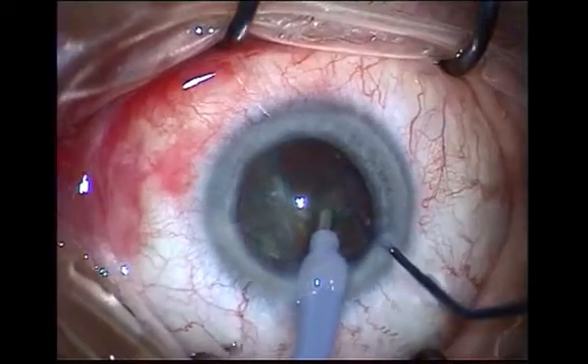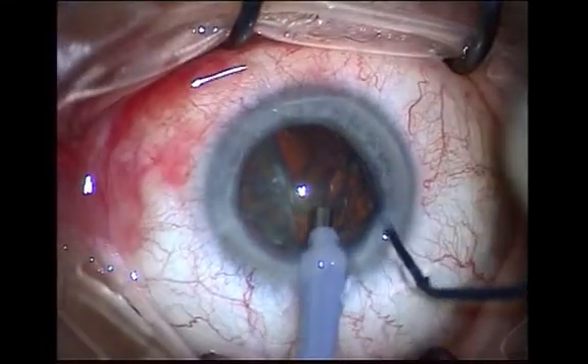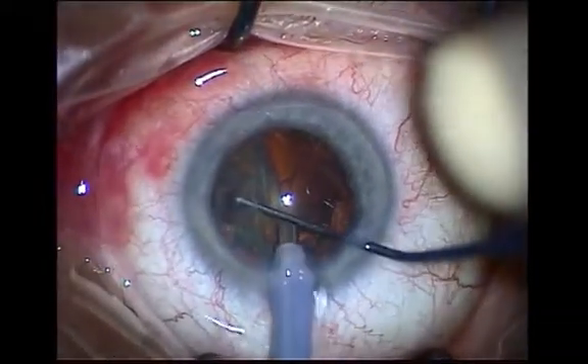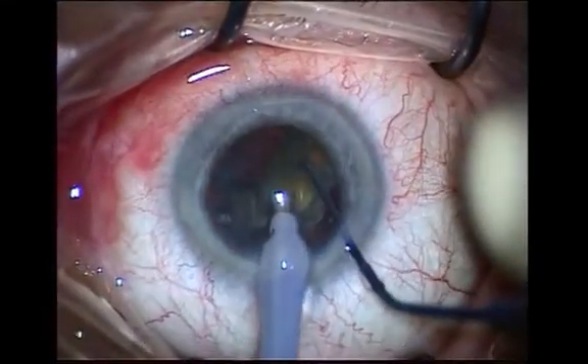Try to gradually aspirate the whole half of the cataract, rolling it out of the bag via the aspiration. Then repeat this with the other half. The key pearl to remember is to safely manipulate the nucleus to the phaco tip, rather than pushing the phaco tip potentially too far and catching the posterior capsule.